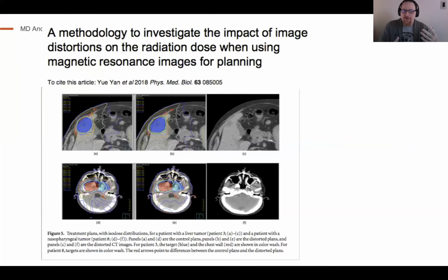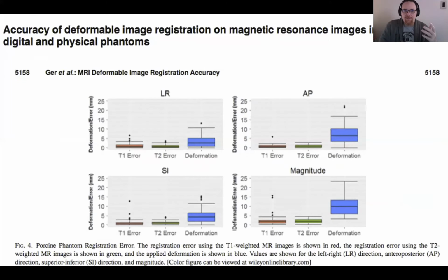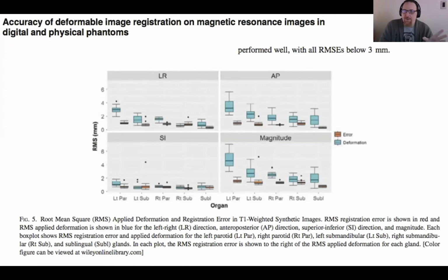Over a period of years, we executed a number of fundamental quality assurance projects. So we first just showed, okay, we can deliver radiation plans and they're not gonna be any worse than the plans we're delivering on CT. So we just showed comparability when we're looking at radiation dose estimation. And we worked to show that we could get geometric fidelity with the MRI images that was approximate to that we would get on CT. So there was a lot of work done with digital phantoms, showing that we could quantify this error. And so now we had a spatially accurate way of quantifying the deformation. And then knowing with these physical phantoms whether we could identify things spatially.